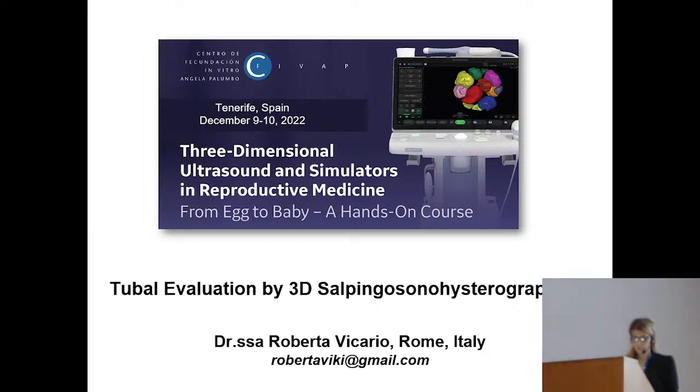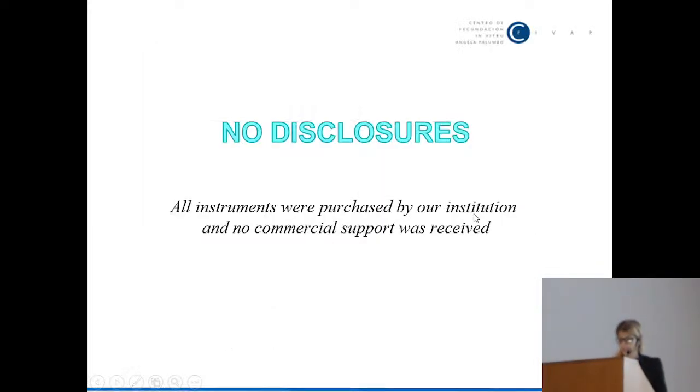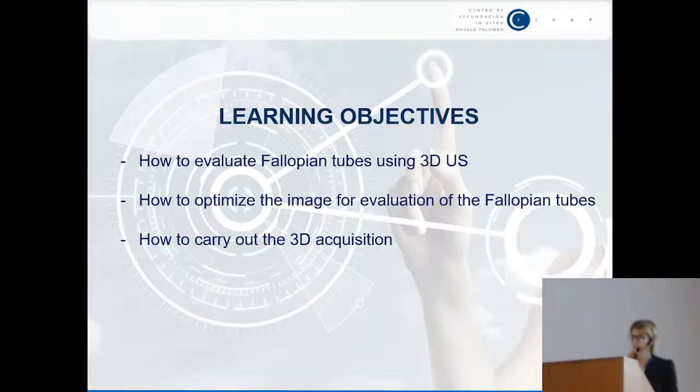I have nothing to disclose, and the objective of my talk is to show you how to evaluate the fallopian tube using 3D ultrasound, how to optimize the image for evaluation of the fallopian tubes, and how to carry out the 3D acquisitions.